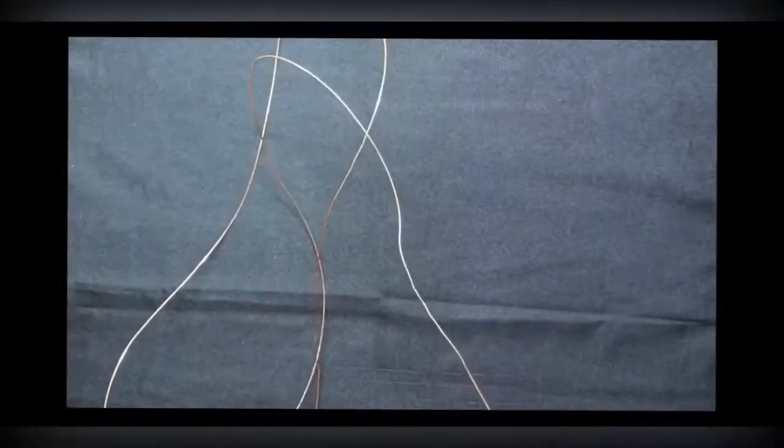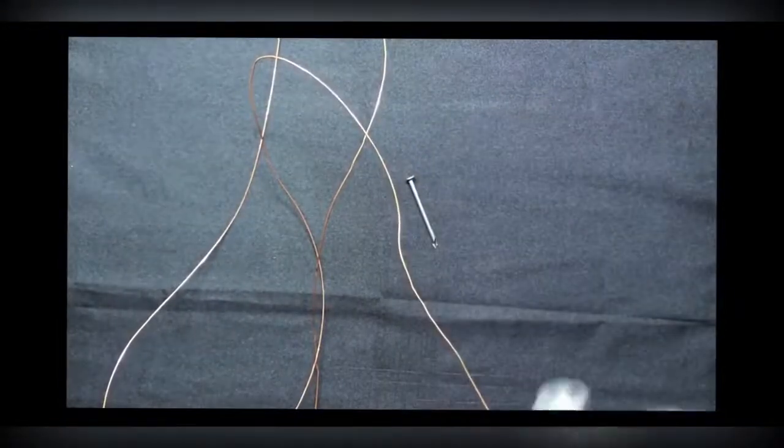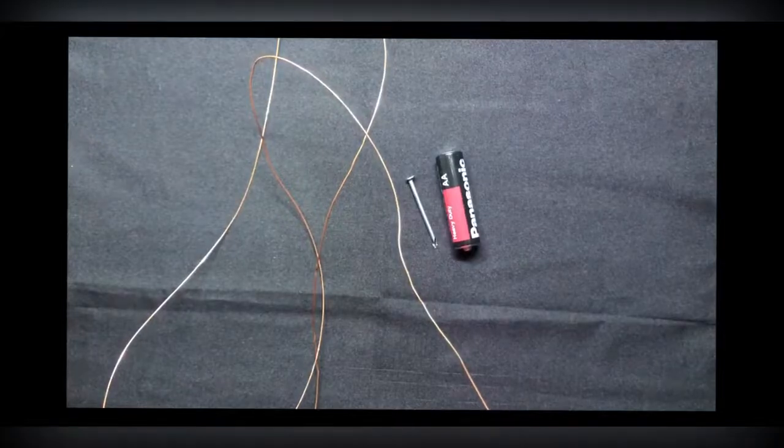An electromagnet can be created by wrapping a wire around an iron nail and running current through the wire.